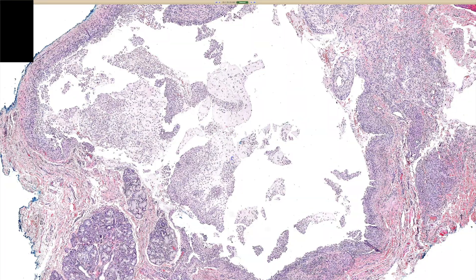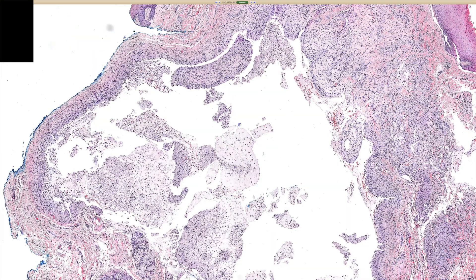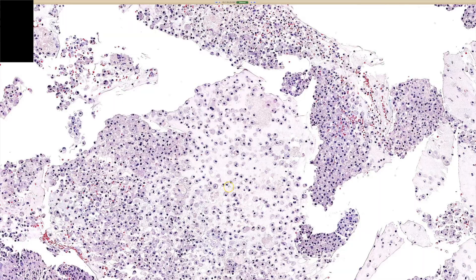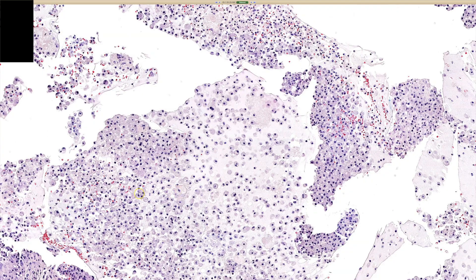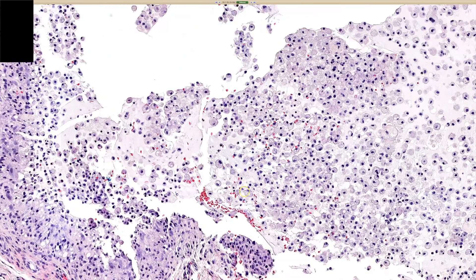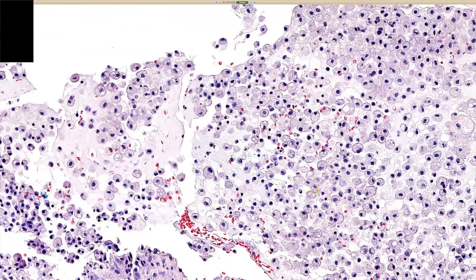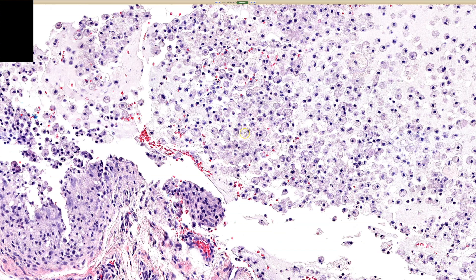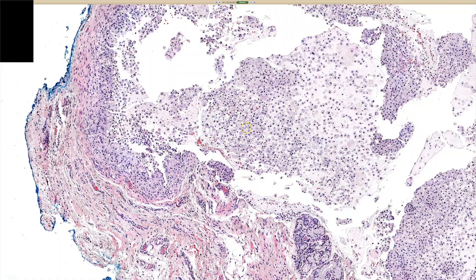The histologic process shows a cystic area filled with amorphous material and inflammatory infiltrate. With all that said, I think this could be a mucocele that has ruptured and is causing a lot of secondary inflammation.